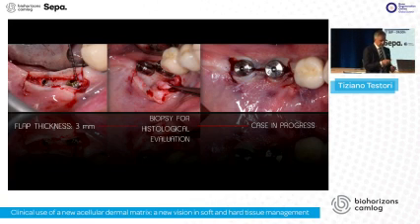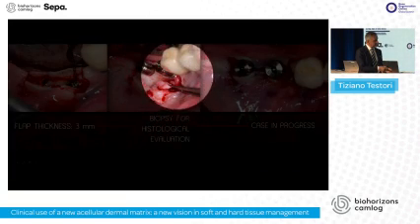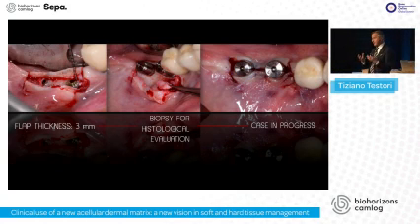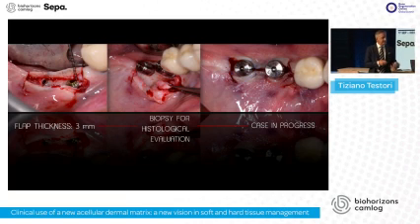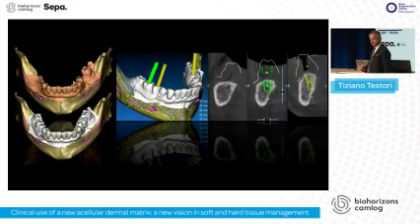And then we took a specimen for a biopsy of this case in order for you to understand which kind of tissue you have when you keep matrices covered over a flap. And this is a case in progress, but we achieved the two goals that we want to achieve on a regular basis for our cases.